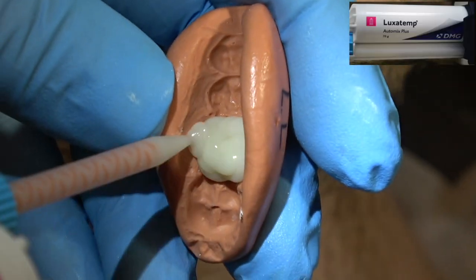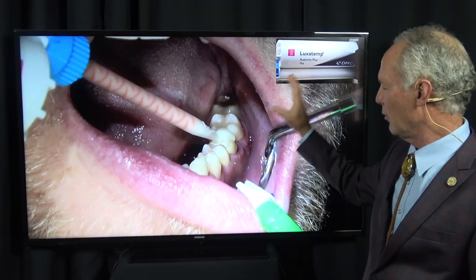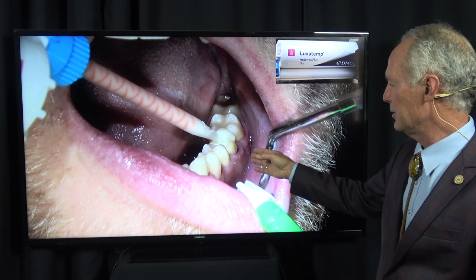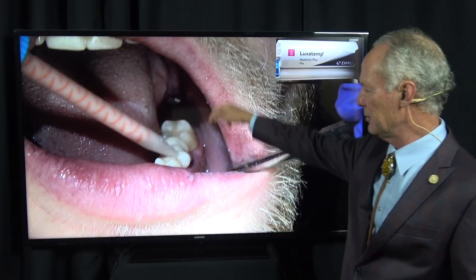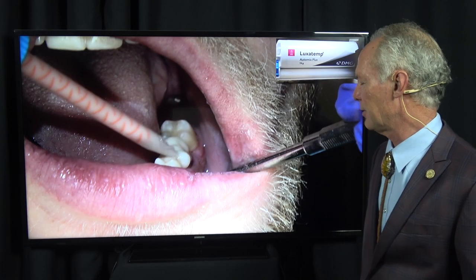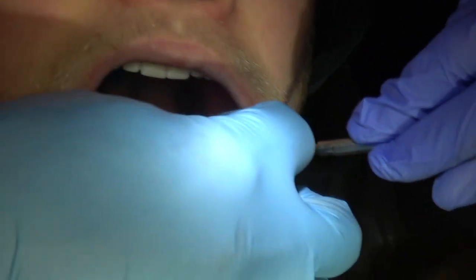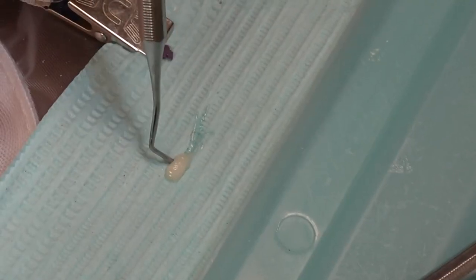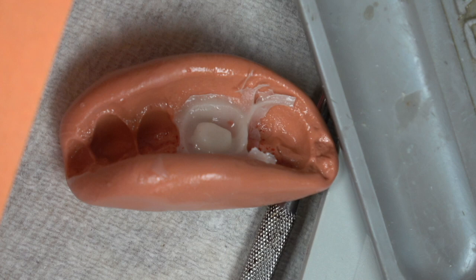And I'm going to place a provisional restoration on that tooth. It's a polyvinyl siloxane matrix. Wet the tooth and squirt the bisacrylate directly on the tooth and place it in the matrix. I squirt it on the tooth to be sure I capture the interproximal parts of the preparation. You want to include at least one tooth on either side of the prepared tooth, and then squirt this little blob on the patient's bib so you can tell when the material is set up.